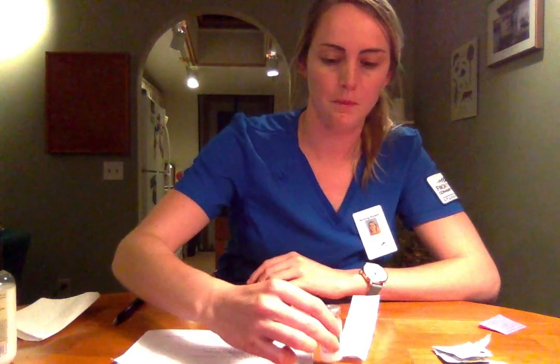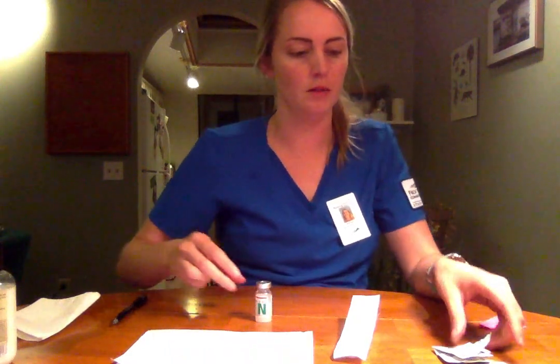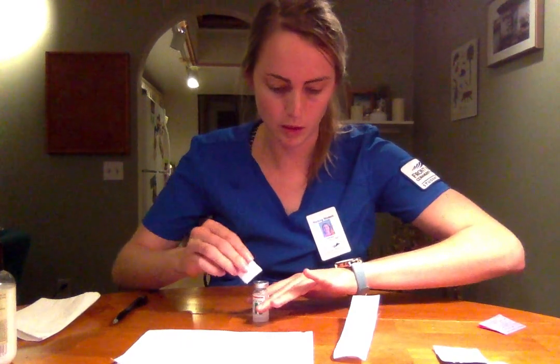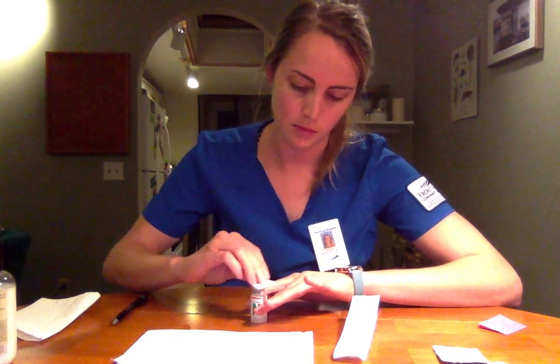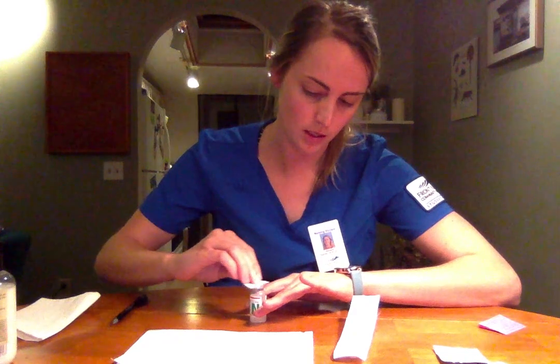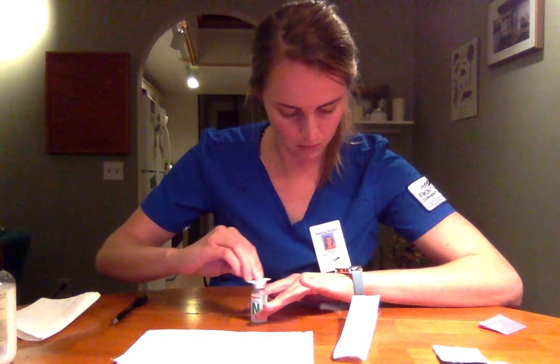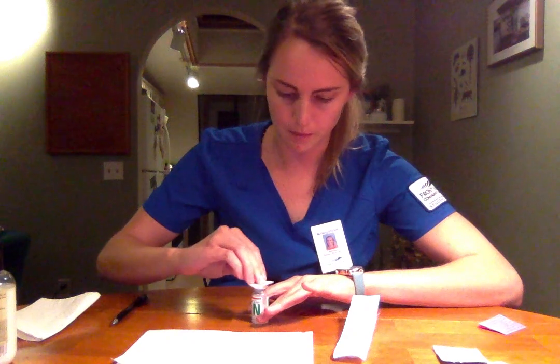Okay. Now I'm going to wipe the top of the vial for 15 seconds. Alright, starting now. Lots of friction, getting it nice and cleansed. Okay.